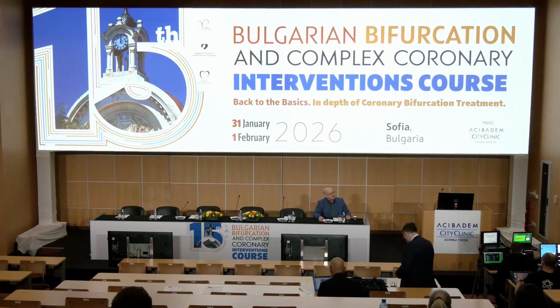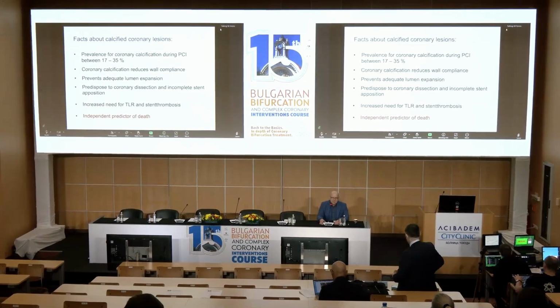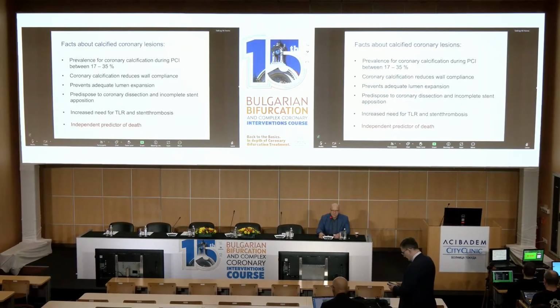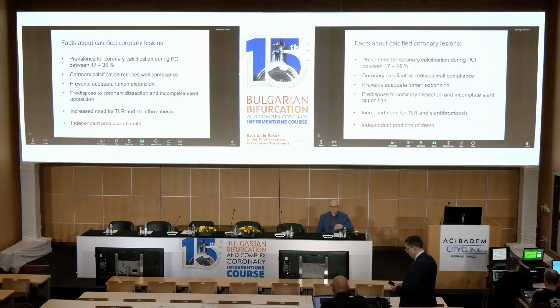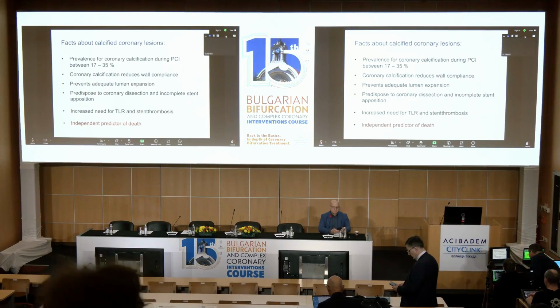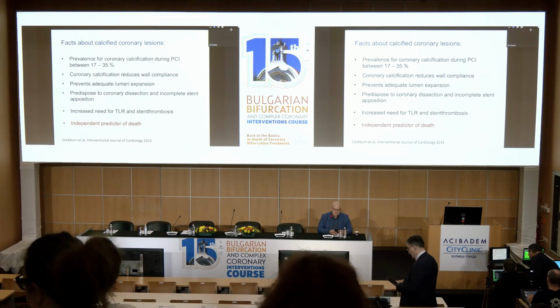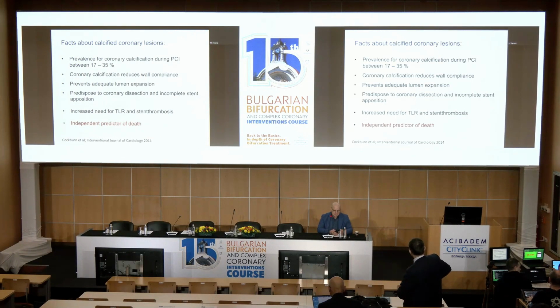Yeah, indeed, the treatment of calcified lesions is an extremely complex issue. And what we know now, yes, our population is aging much faster than we personally believe. We see now every day many more really very complex calcified lesions. And the more calcium, the more problems can occur during PCI, because wall compliance is definitely reduced.